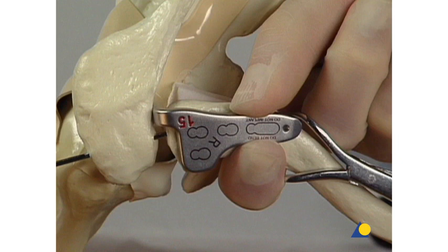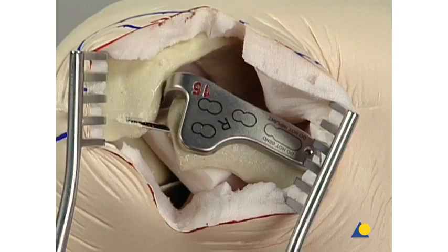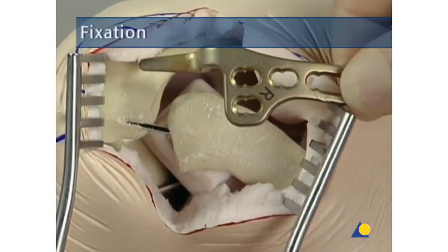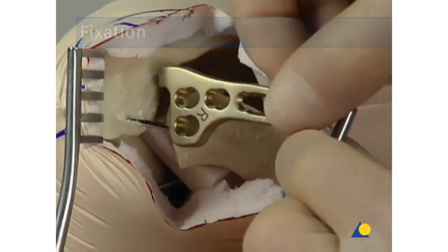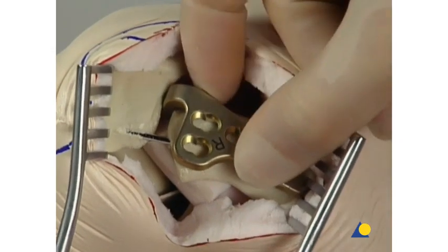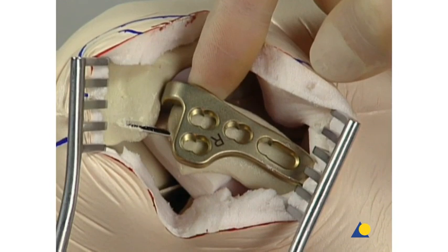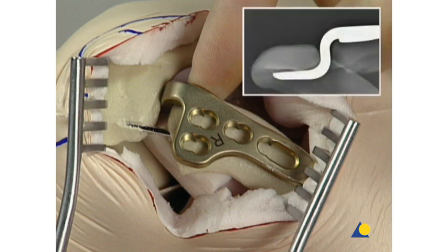The trial implant should never be bent or implanted. Once the hook size has been determined, the trial implant is removed and the selected implant is positioned. The implant is placed in the position that was determined using the trial implant. If needed, the plate can be fixed temporarily with a K wire through the drill sleeve in the distal hole to fix the distal part of the plate. Temporary fixation can also be done by introducing a cortical screw in the most medial plate hole or by securing the plate with a clamp. The correct position of the hook relative to the under surface of the acromion is verified.